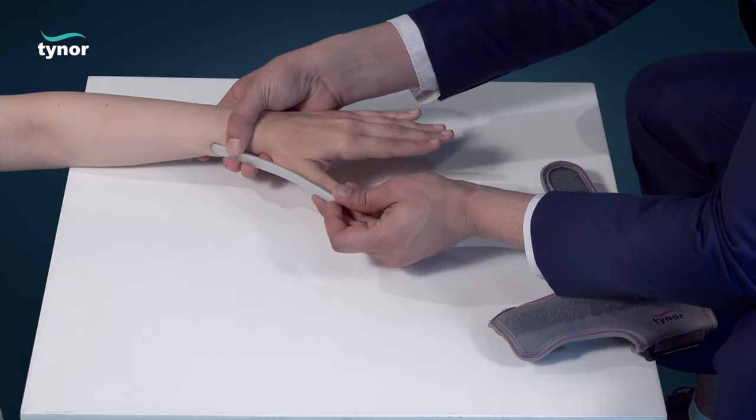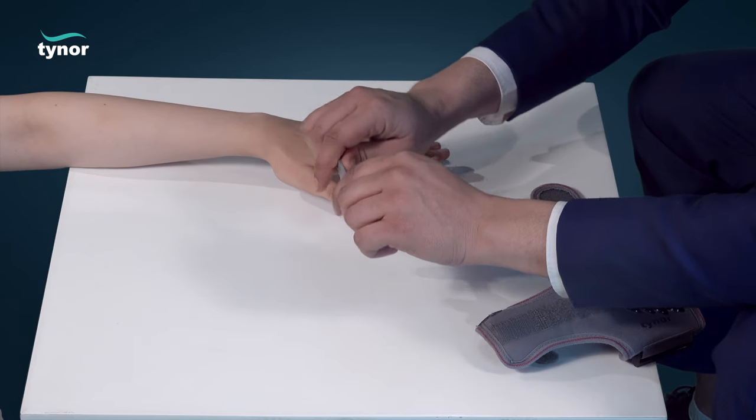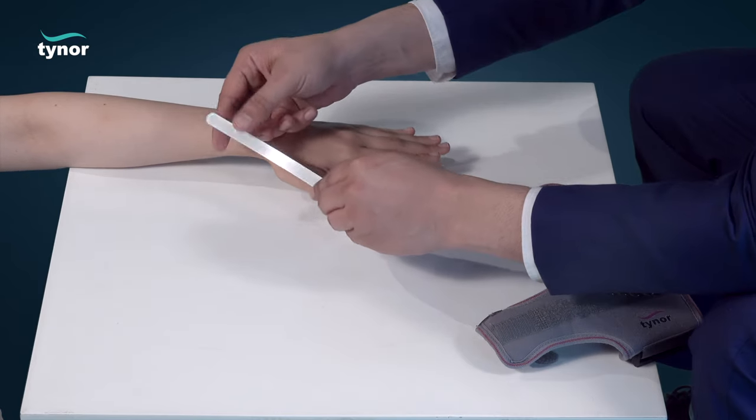Now match the contours of the splint to the contours of the thumb according to the required thumb abduction.